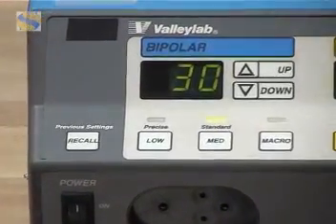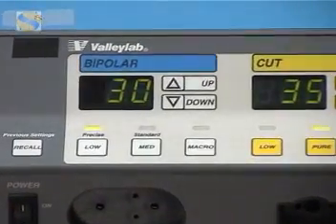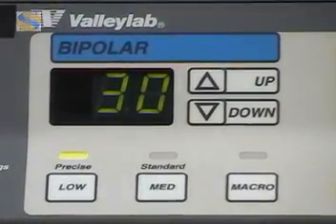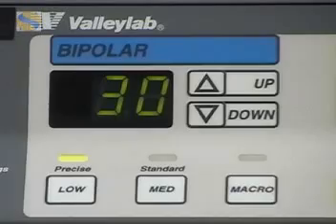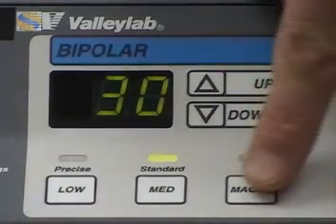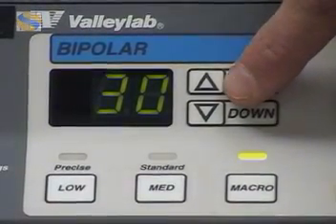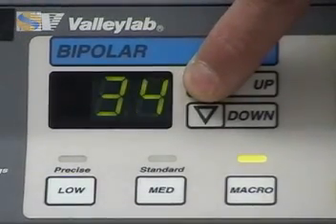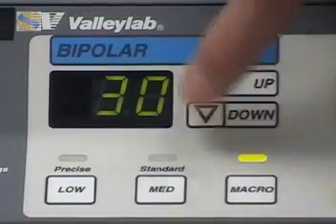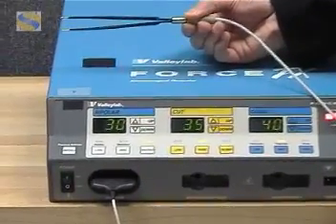Now let's look more closely at the different modes used in diathermy, starting with bipolar. The precise setting is used for surgery involving delicate tissue work, especially for neurosurgery and in ophthalmology. The standard setting is used for the vast majority of bipolar work, and macro is used for bipolar cutting. The power output is displayed in watts and is adjusted by pressing the up-down arrows. Directly below the front panel control is the socket for attaching bipolar accessories.